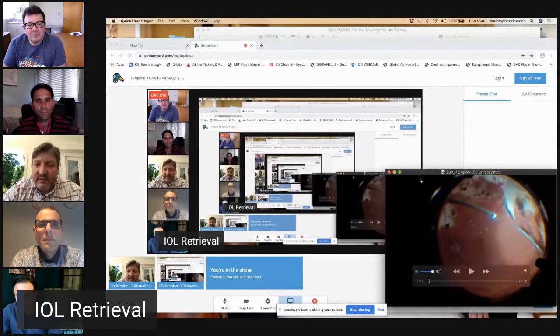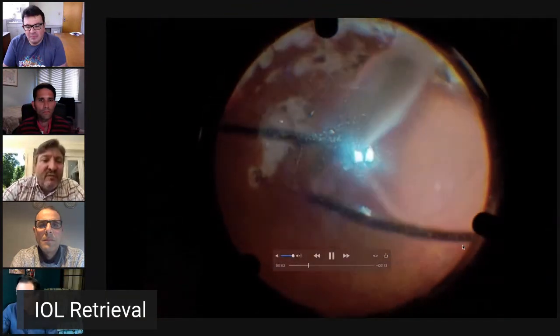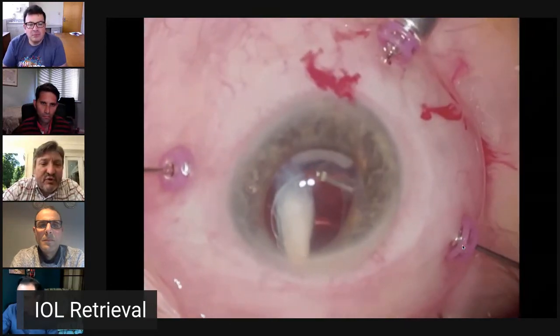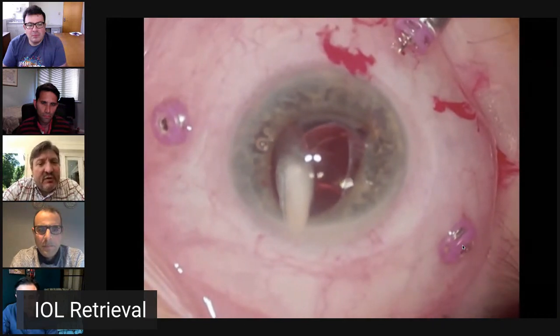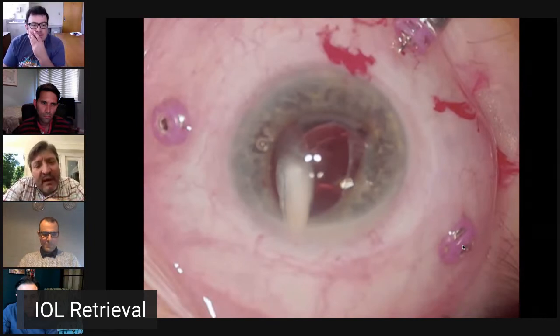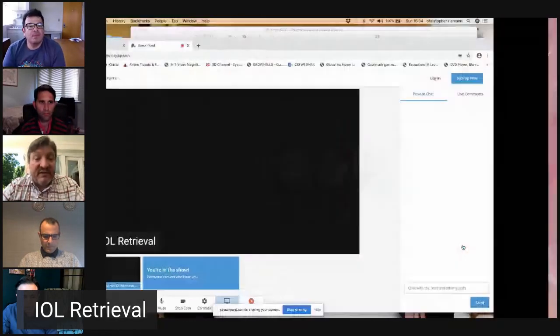And another video that's nice to use, you can even use suction from just a 27 gauge cutter. So here's an IOL capsular bag complex, and we've just pushed it through the pupil with the light pipe using a 27 gauge cutter. It's very powerful. You just have to be sure to turn the cutter port off and either engage the capsule or Soemmerring's ring if it's an IOL capsular bag complex, or put the cutter mouth into the angle between the optic and the haptic. And it works very well to lift these.